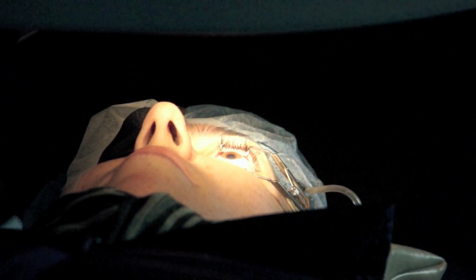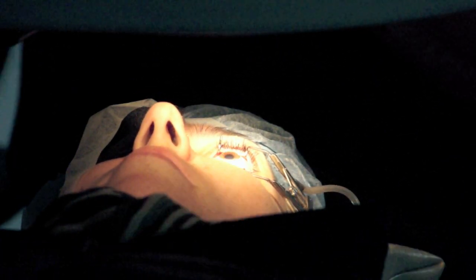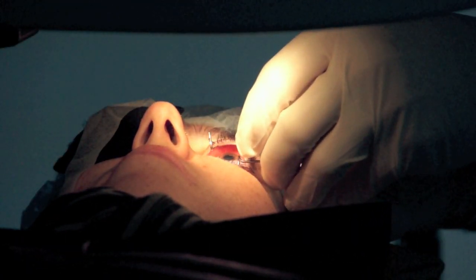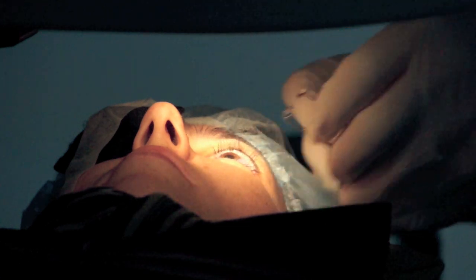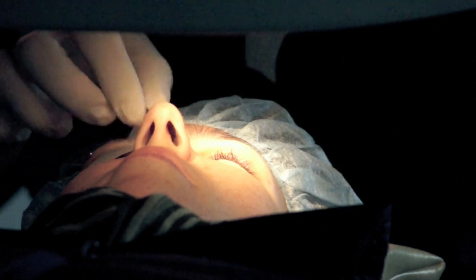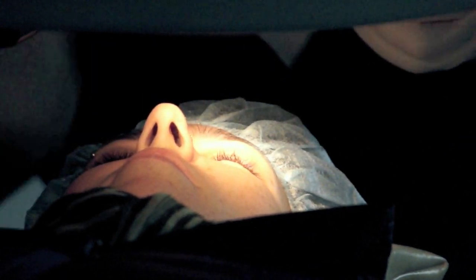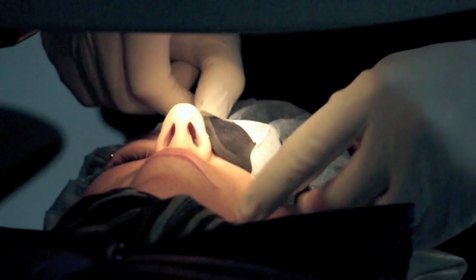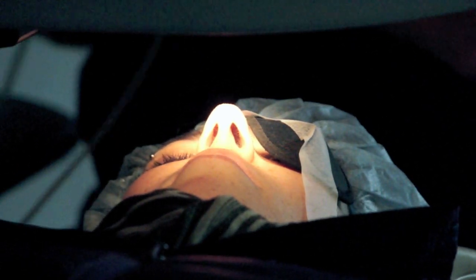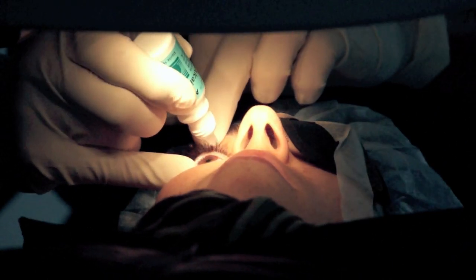Everything went really well, so we're just going to wait about a minute, and then we'll get ready to get our eyes. Take this out for you. Okay, close your eyes. Good job.